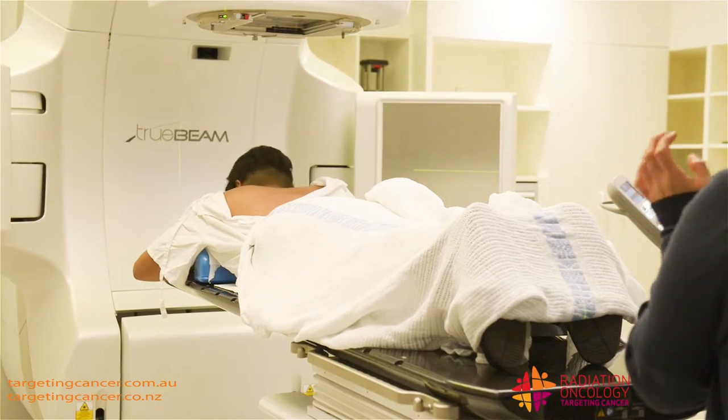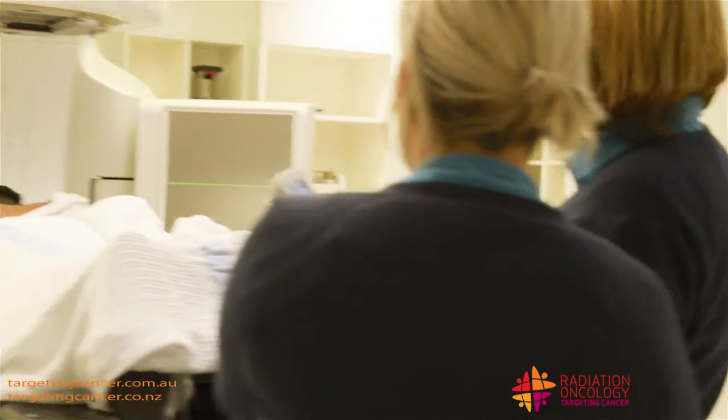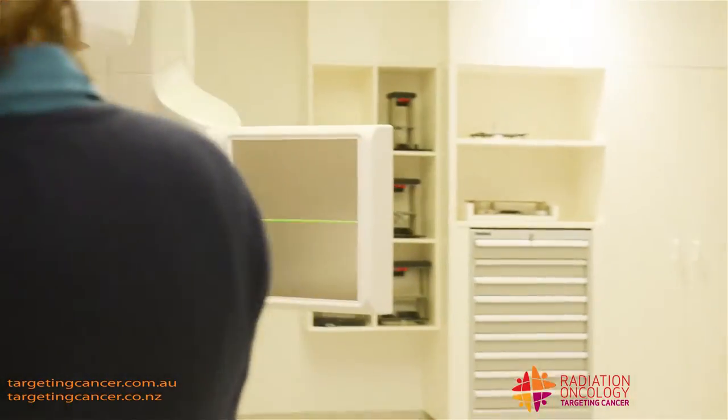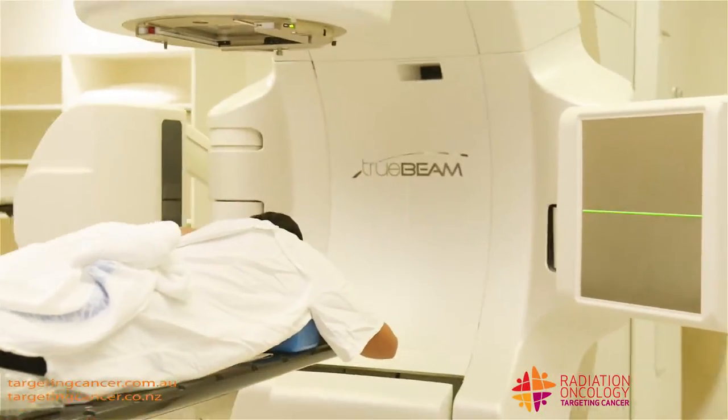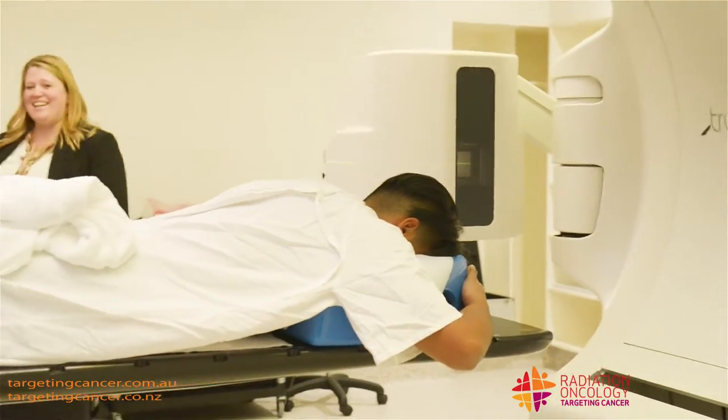So you set someone up and make sure they're nice and comfortable. Sometimes if someone's got a symptomatic bone metastasis, we need to make sure they've got some pain relief on board before they come in for treatment, because it's not the most comfortable of beds, as you can see.